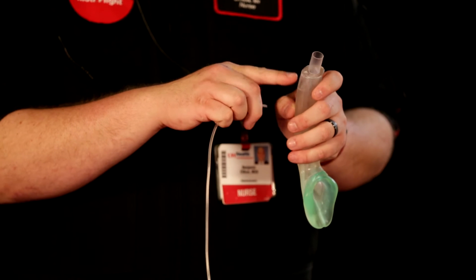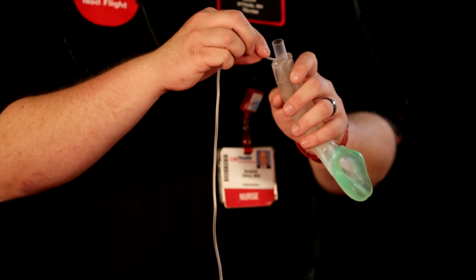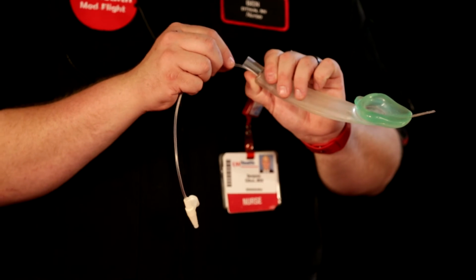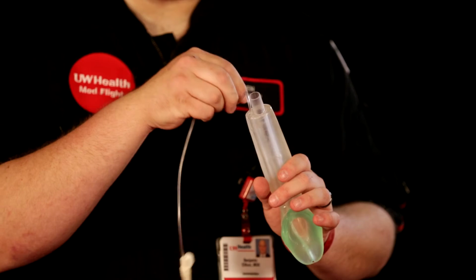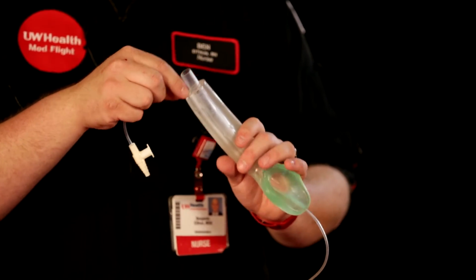They also do have that suction port as well. Many of them will have the side port. Not all of them do, so just make sure you understand if your devices have this or not. But you can do the same thing with preloading it. Again, you want to make sure that it's going to pass through, because the size can be a little bit misleading. There is a little bit of a turn as well, so just make sure that the catheter goes in easily. Pull it back, seat it, and then again, you can drive this down through the esophagus into the stomach to decompress as well.